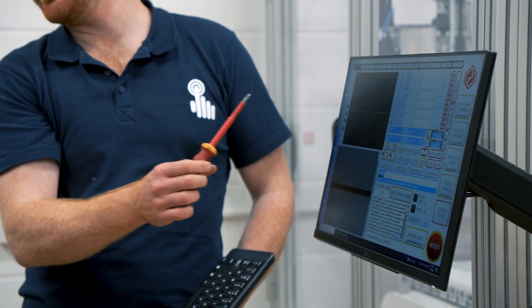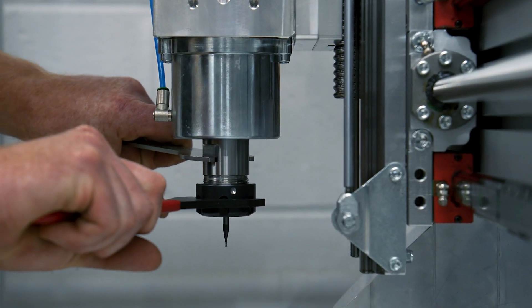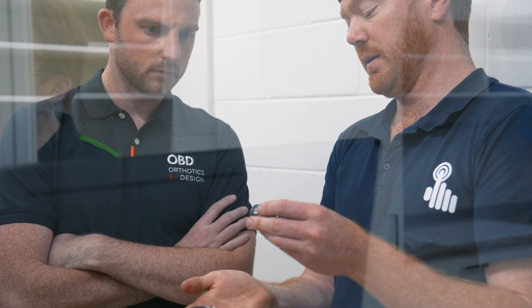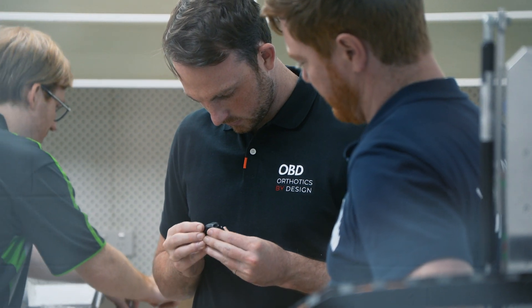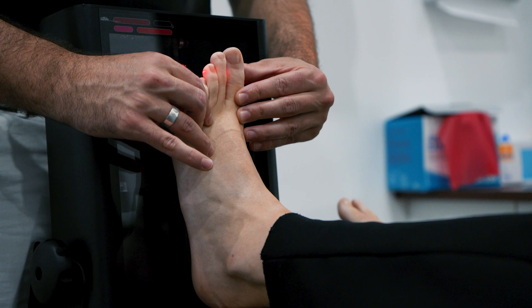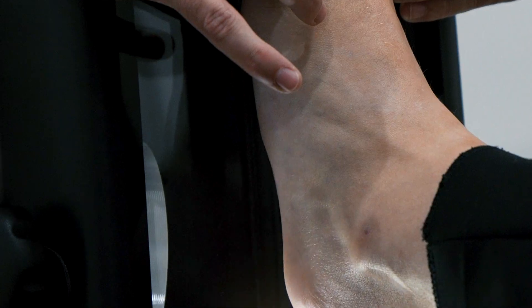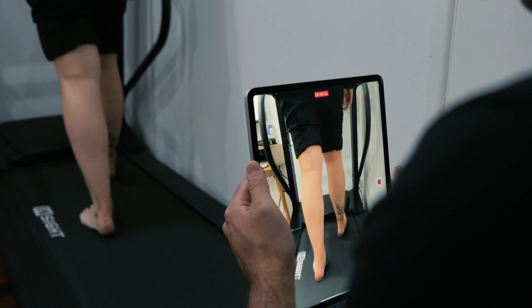We decided to have our own manufacturing facility because we weren't getting exactly what we wanted from other manufacturers — too much was left in the hands of junior designers. Being the podiatrist, you've seen that patient and you want to control that process start to finish. We see the patient, do our assessment and biomechanical gait analysis, scan their foot, use the software to design exactly what's needed, and then we actually manufacture. We have every step down pat and we're in full control.